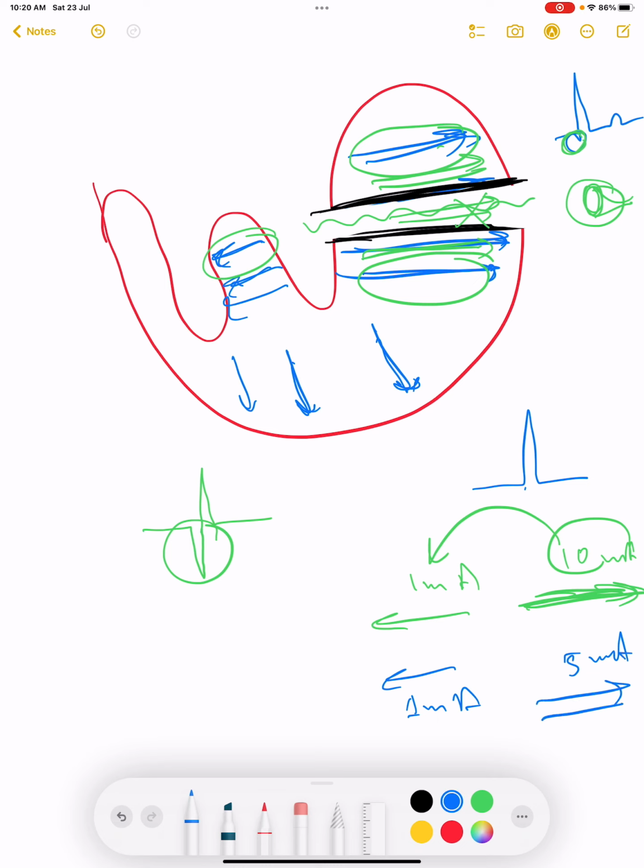So now the difference is less, and that is why the Q wave will be more prominent, wider and deeper, mostly wider in case of myocardial infarction. So that is why in MI, when the tissue is damaged, after some time we will see the appearance of Q wave. When the Q wave appears, it means that the tissue is already lost and the myocardial infarction is old.